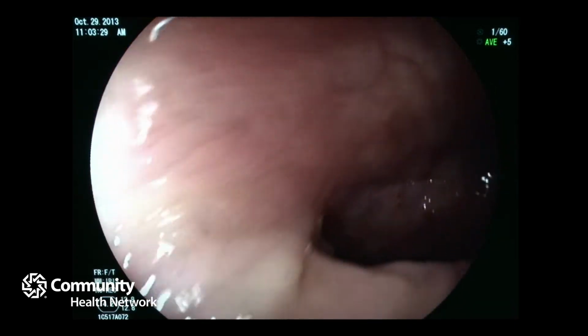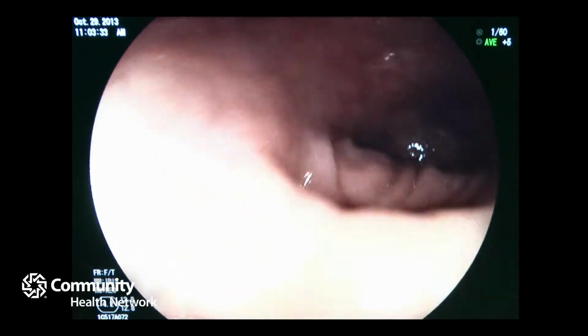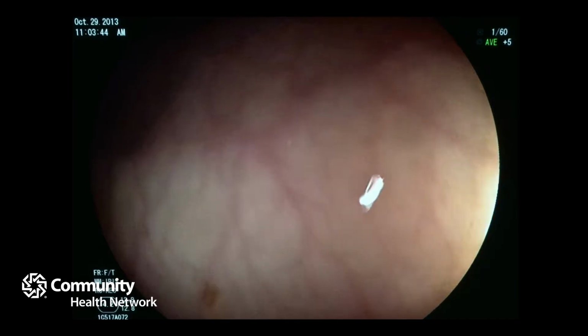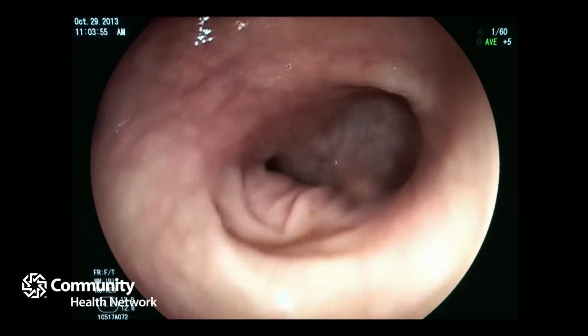And then for bigger polyps, sometimes surgery, or oftentimes we try to refer them to people that have more advanced techniques. Our colleagues at Gastroenterology Care, through Dr. Hollander and Harrison and Chacha, they have some techniques of removing them mucosally through a colonoscope that are quite advanced. So that's been great for patients. Or sometimes we do combined larger polyps with a scope and surgery. Again, trying to avoid surgery if we can, but sometimes we can't. But the most common ways will be the way I'm describing right now.